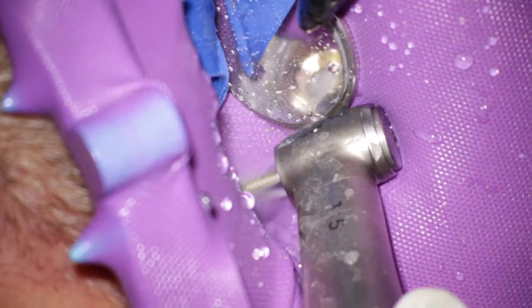You can spot the post a bit, but the opening is way too small, so I had to massively extend its diameter. The post was entombed in resin, so the only way to remove it was to remove all the surrounding resin, but I also had to preserve as much of the post's body as possible, because it might be possible to only screw it out with a handle grip. But the truth was another, as you will see a little bit later.